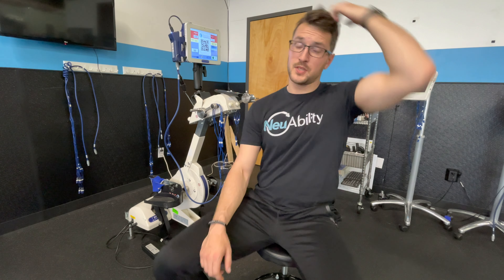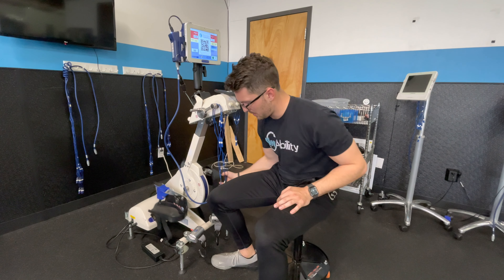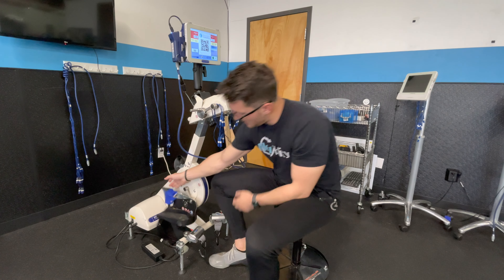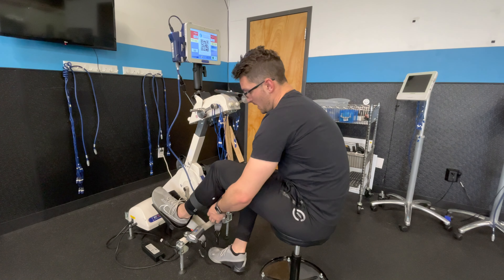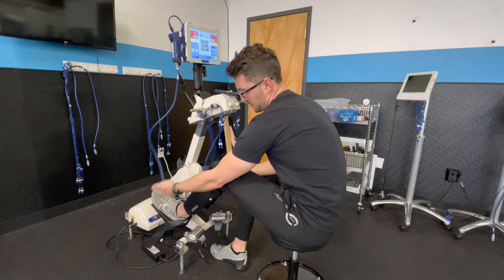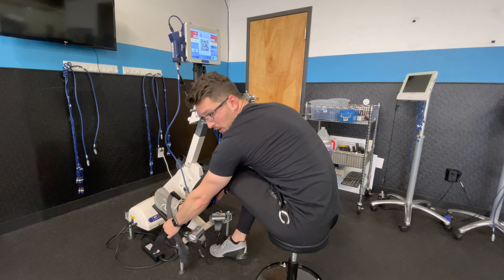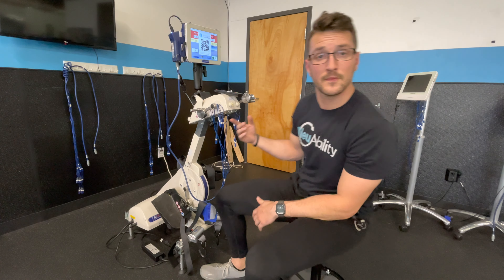This machine is very customizable. This one is primarily used as a bicycle — with these bicycle leg holders we can get a person's leg hooked into position, strap the leg guide down. The leg guide is adjustable, extending up and down. Once the leg is set, straps flip right over the top to allow the foot to be secured in place.